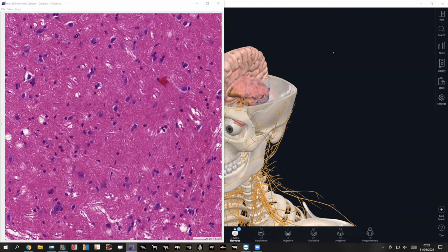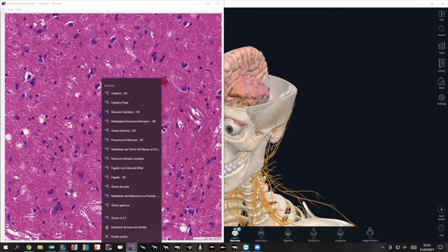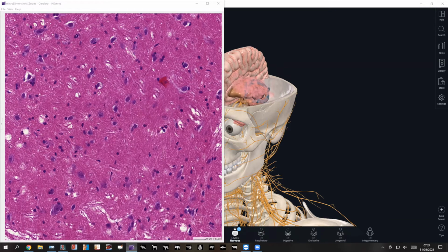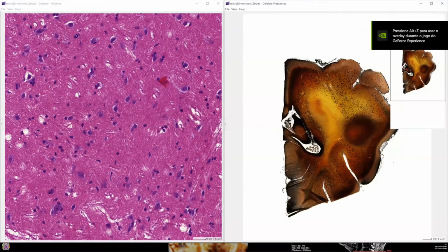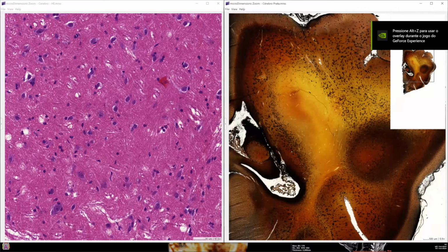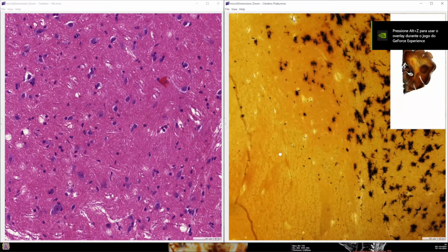All right. Now I think we can have a full screen sharing, so you can see all the resources. So then we have the healthy part of the histological view, and also the unhealthy part of the histological view. You can see that on the screen. There's a quick delay here for us on what he's doing, but we can definitely see that.